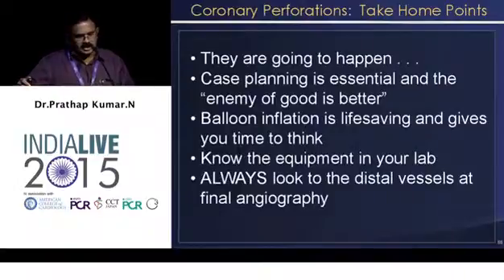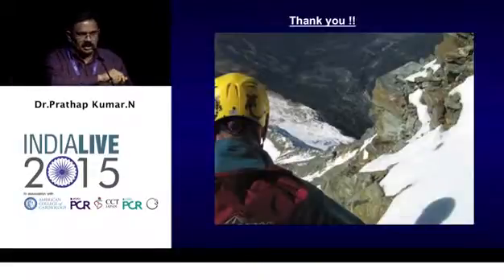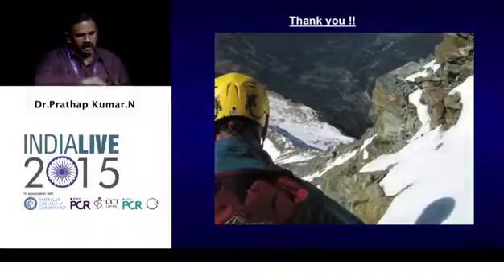Case planning is essential and the enemy of good is better. Balloon inflation is life-saving and gives you time to think. Know the equipment in your lab. Always look to the distal vessels at the final angiogram and always prepare for the worst, even for the best treatment given by you. Thank you.